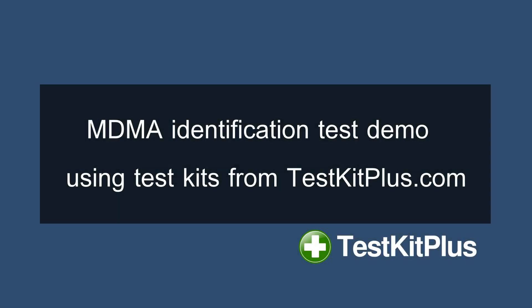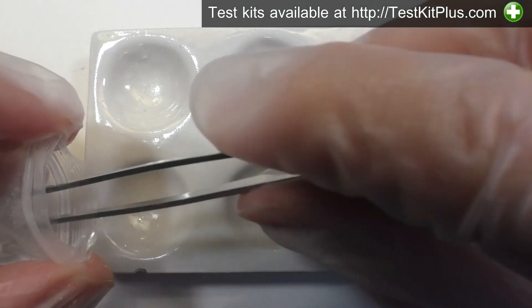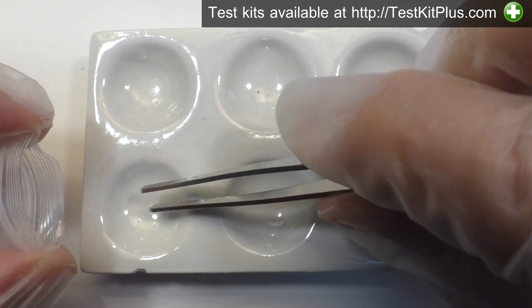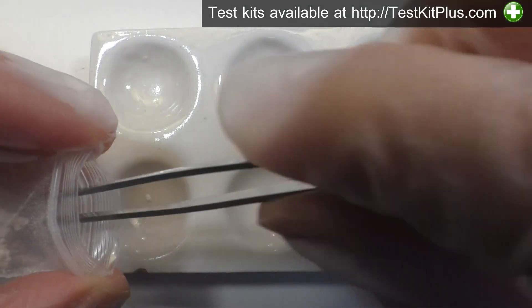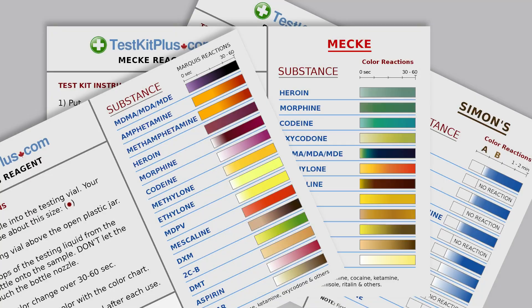Hello and welcome to this TestKit Plus video, where I'll demonstrate testing a sample reported as MDMA, otherwise known as Molly, Ecstasy, and a host of other street names. We'll see if the color results are consistent with what we'd expect for MDMA. I'll use an MDMA TestKit package from TestKit Plus, which includes three tests. A color reaction chart is included with each test.